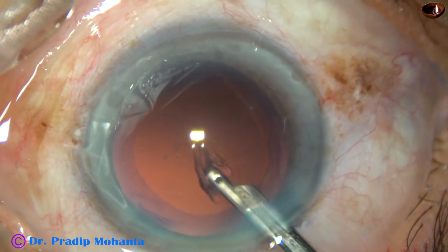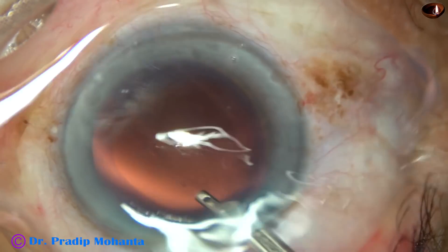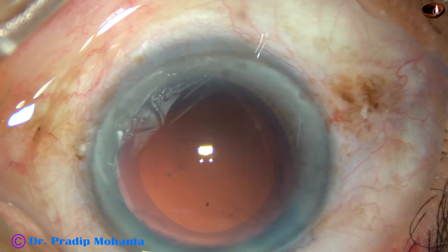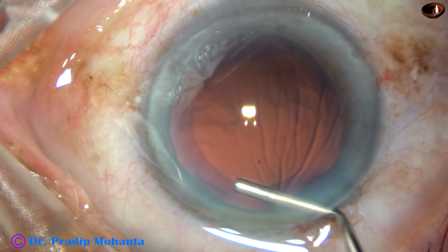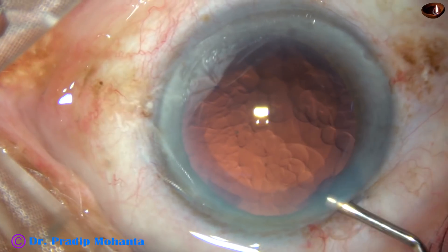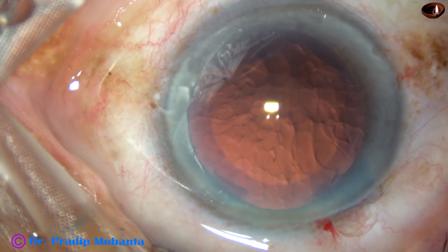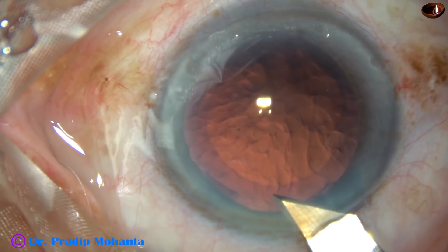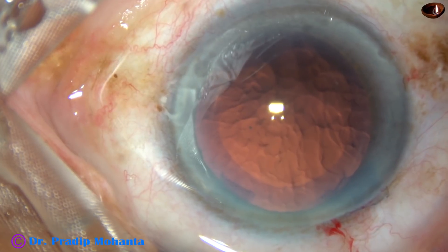Still some cortex is there — this is the last bit of cortex. And now I apply some visco. This is 2% hydroxypropylmethylcellulose, not a lot of it. I enlarge the main wound because I will be using a b-cartridge, and I want the cartridge to go into the anterior chamber.